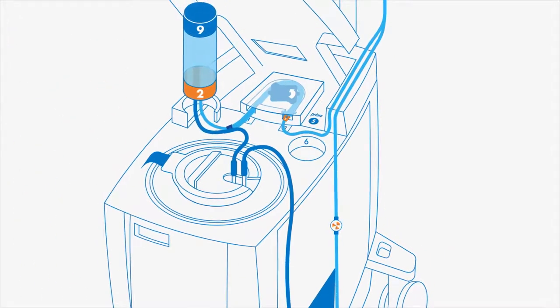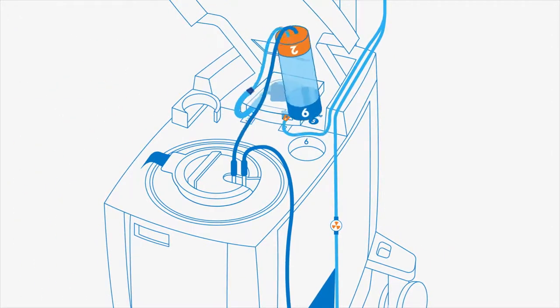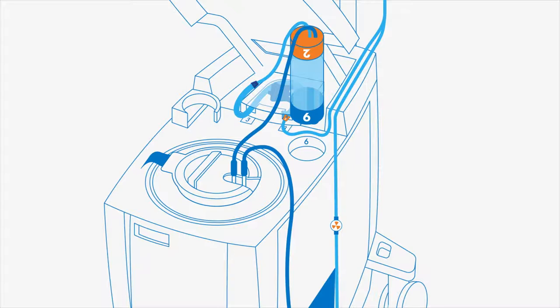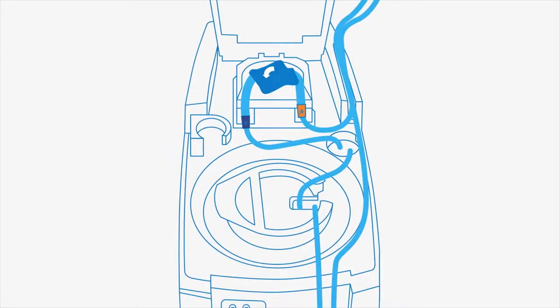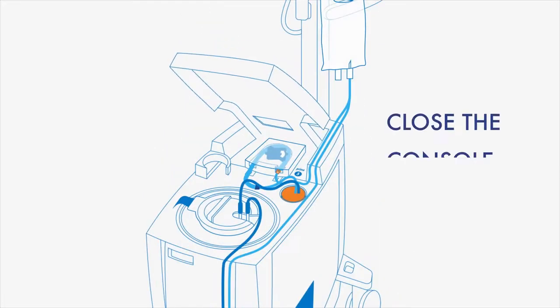Once the startup kit has completely filled with saline, place the air trap, blue end down, into the blue chamber, blue 6 to blue 6. Check to ensure the tubing is correctly aligned and close the console top cover. Console setup is now complete.